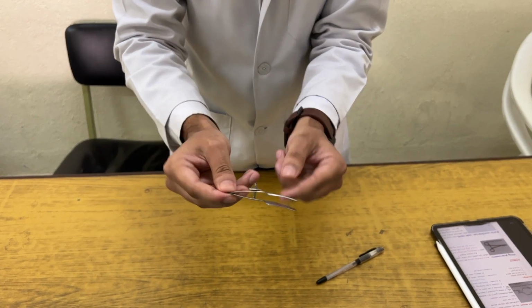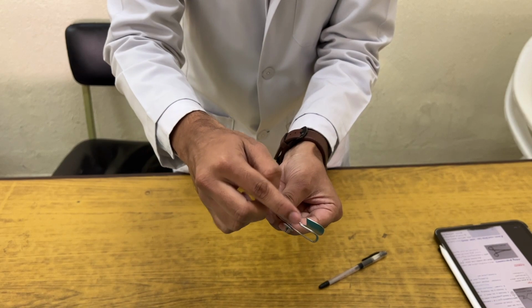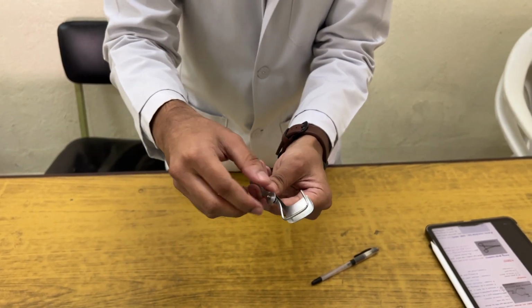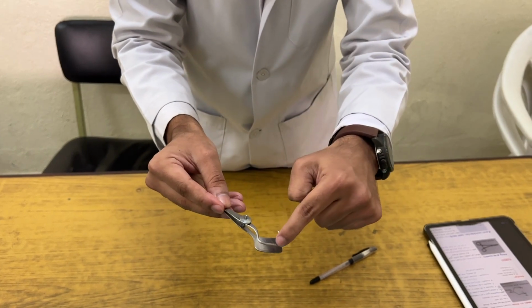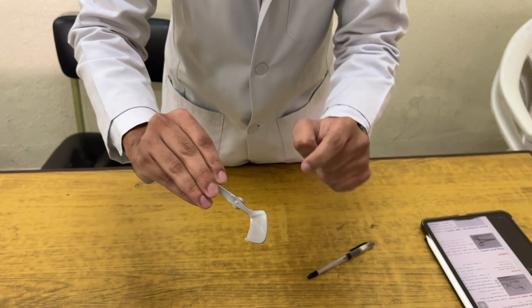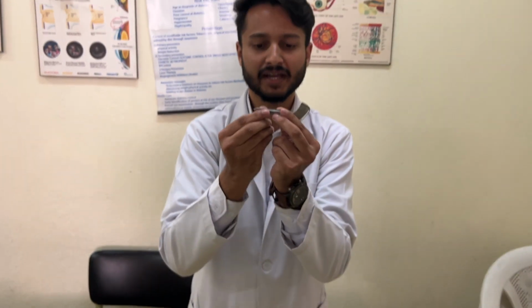It is not universal because it has different uses in different eyes. Roughly, we can see that this margin is very sharp, so because of that reason, it is not used in both eyes. So how do we use it? You should make sure that the U-shaped rim side is facing towards the skin, and this plate should be facing towards the conjunctiva. Let me show this in my eye, and the handle should be held temporally.